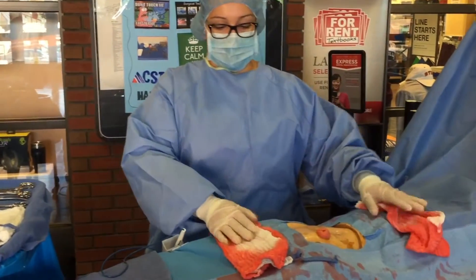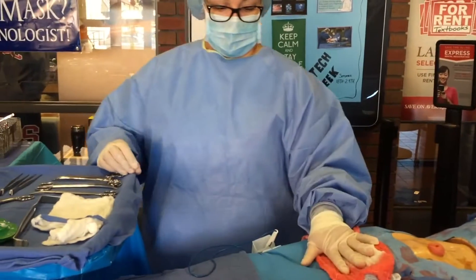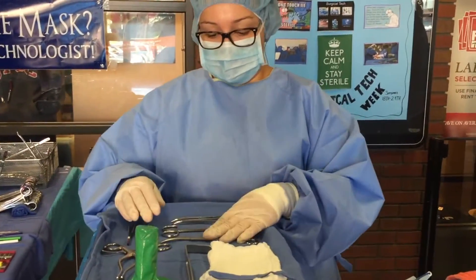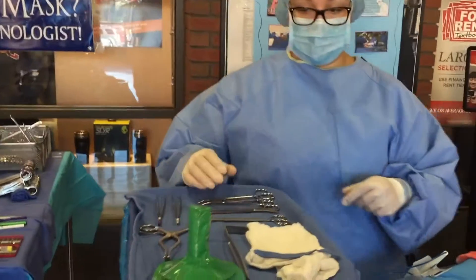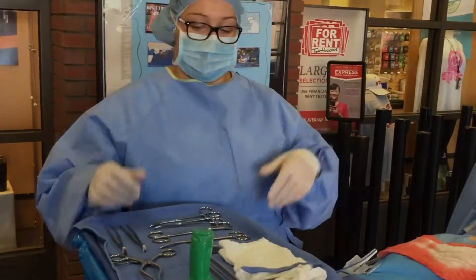What we have on our field right now are some sponges — they're a little bloody. This is our field and where we operate from. Where we get our instruments that we need for right away is here on our Mayo stand. So we have some scissors, some clamps, forceps to grab some skin, and retractors to open up if we need it. I also have a sponge and our light handles that we hook up so that the surgeon can move the lights around.